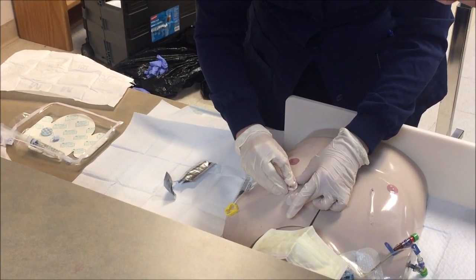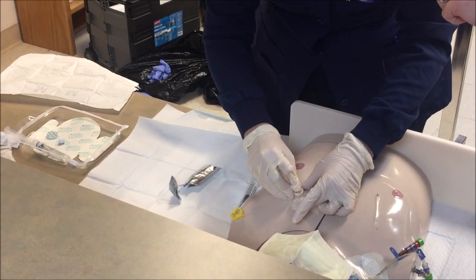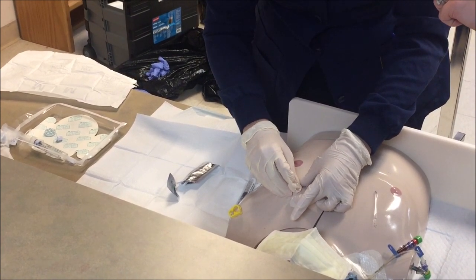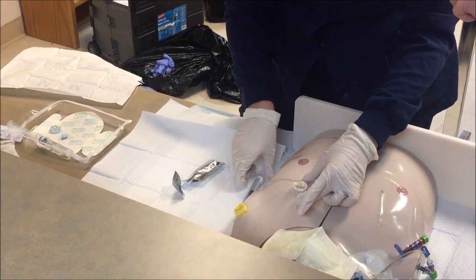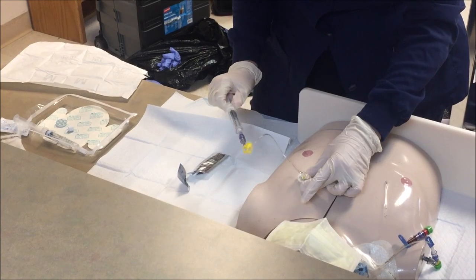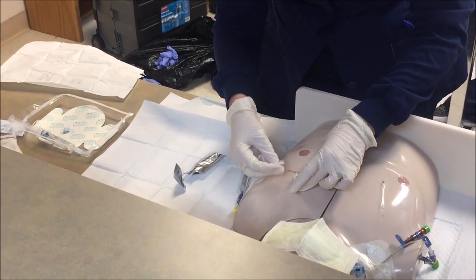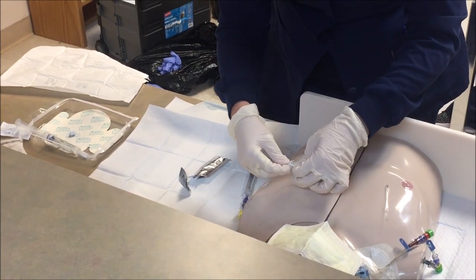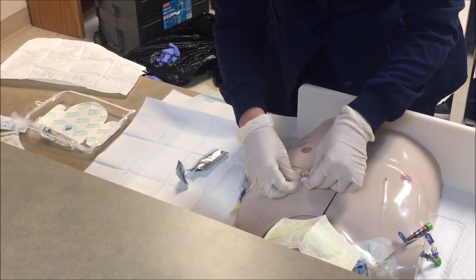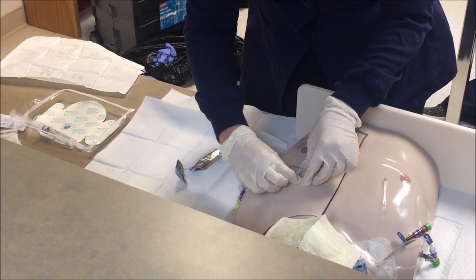Note that resistance will be felt as the needle reaches the base of the reservoir. Once you have successfully placed the needle into the access site, remove the protective cap from the wing needle if applicable. Stabilize the needle wings and apply the antimicrobial patch, ensuring it is right side up. Blue to the sky is an easy way to remember it.